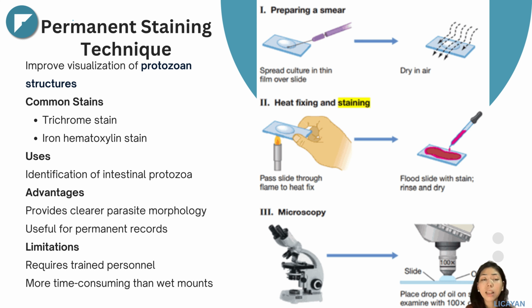For more detailed examination, we use permanent staining techniques.